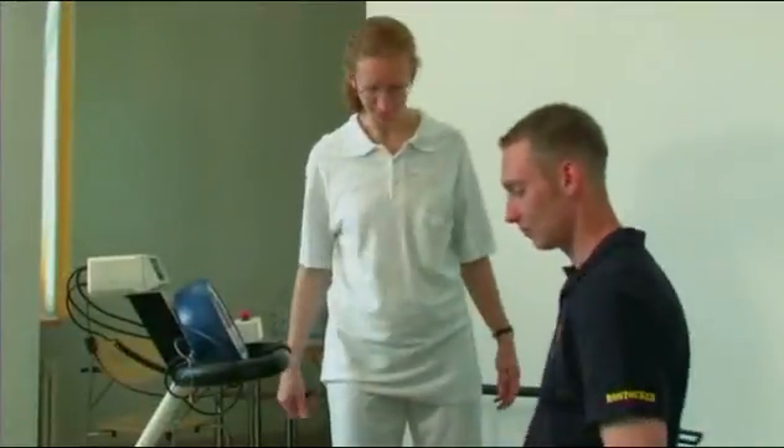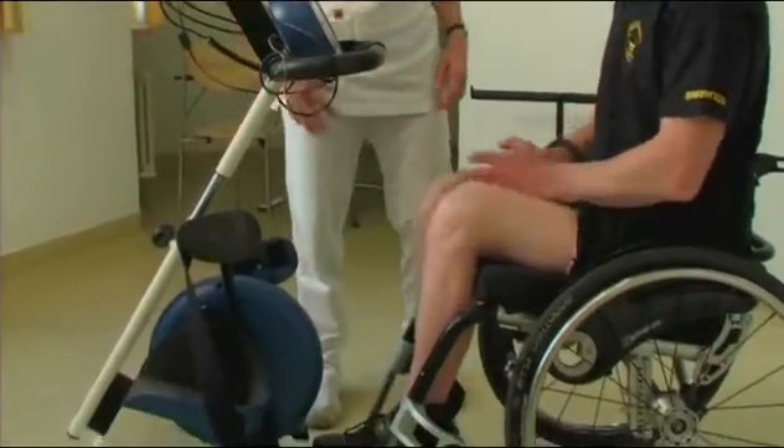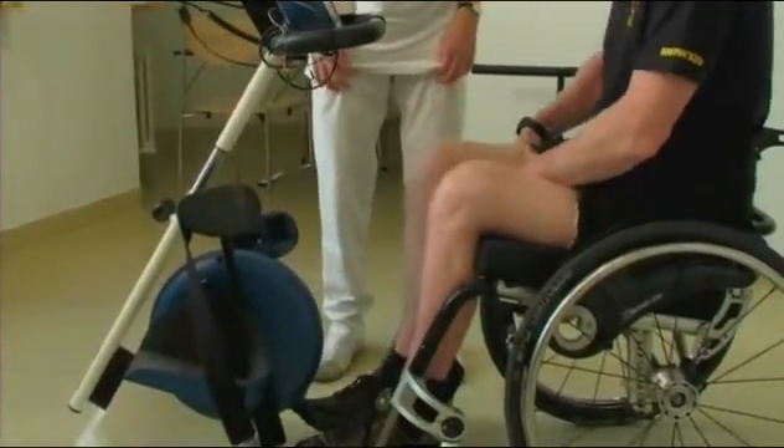The RehaMove system can also be used easily in people's homes. Most frequently, the muscles of the thighs, buttocks, and lower leg are stimulated.